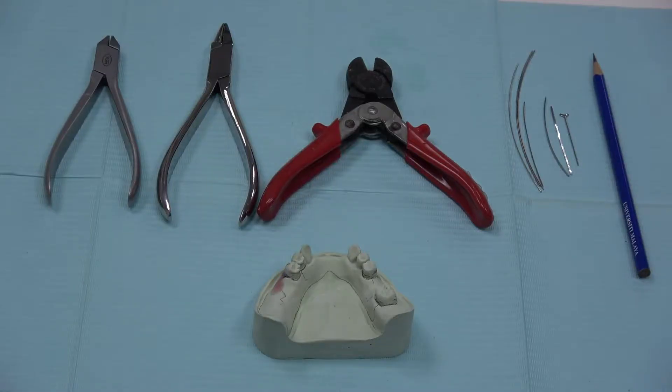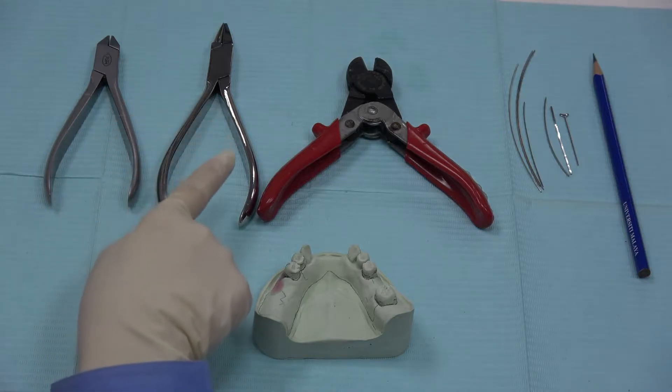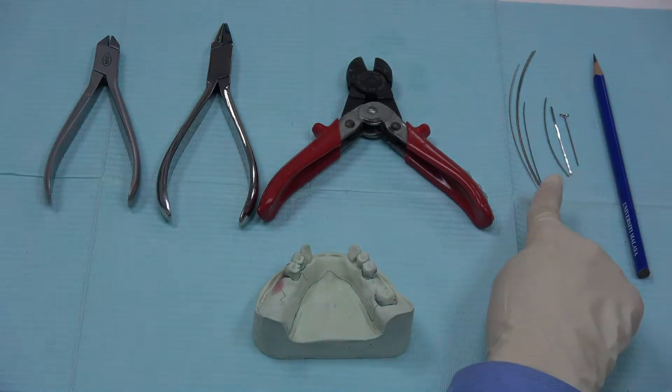Today we are going to do wire bending for components for partial dentures. The equipment that we need for wire bending are Adam's plier, spring form plier, wire cutter, and stainless steel wires.